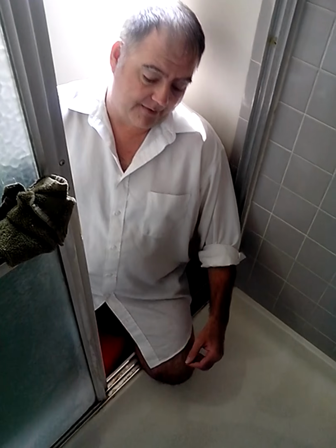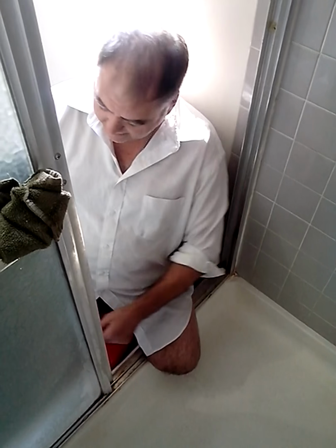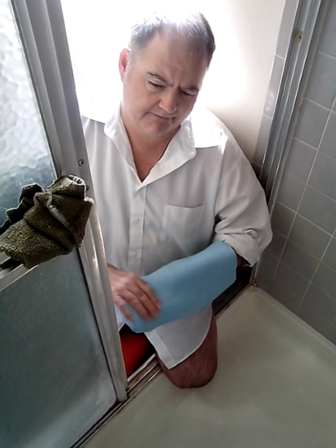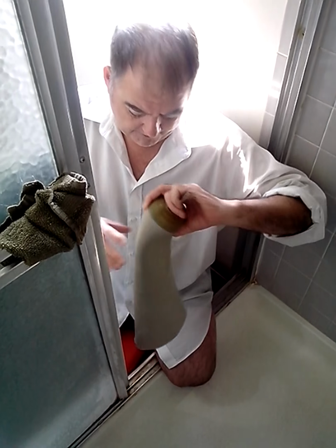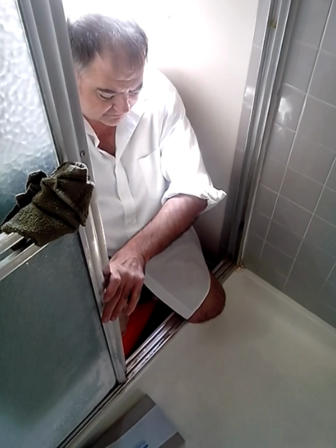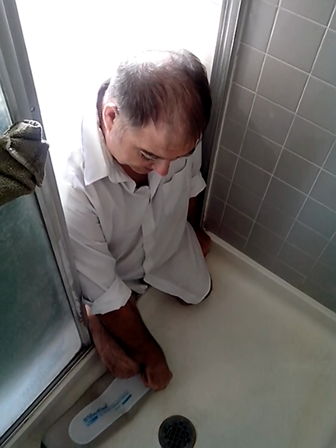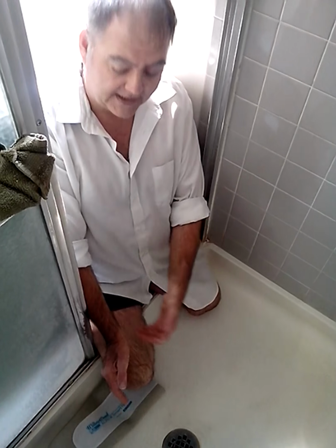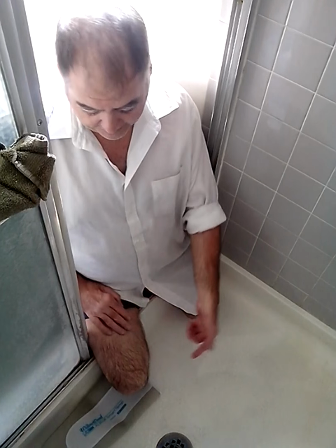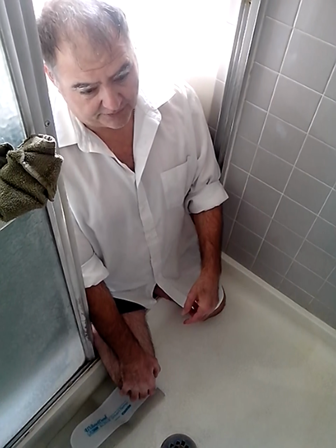So what I'll do is I'll just go ahead and bring my liner in. Well, I got my knee pad on because I always have my knee pad on. I'm going to take my knee pad off here. I'm going to go ahead and take my liner off. Oftentimes I have the liner off already and just have my knee pad on. I'll put it in here in the shower, and I'm going to turn myself around on my little red scooter, get myself prepared to come into the shower. Now, like I said, oftentimes when I first get up in the morning, I don't put my liner on, so I normally have a knee pad on in the morning when I take a shower. But I also do like to throw my liner that I'm about to clean, because I do that in the shower, I throw that on the ground because it makes for a really good knee pad.